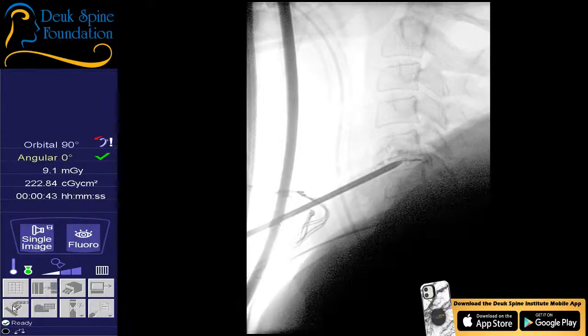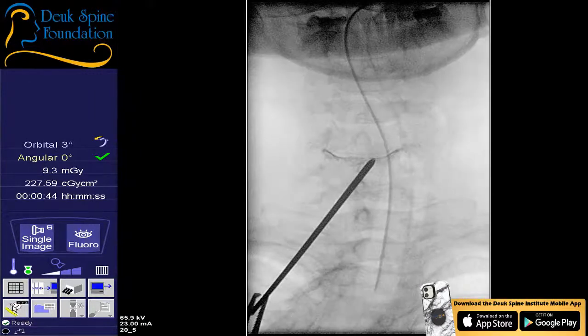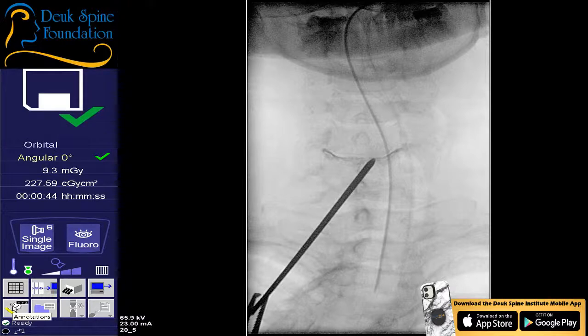Shot? All right, there's some dye. It's gone out the tear in the back. You see the tear? And it's outlining the herniation. Give me an AP. So we just did a discogram at C5-6. Shot. Perfect. You see tears on both sides. So she's got tears on both sides with dye going out both foramen, but she's only symptomatic on the left. Really, that's her primary symptomatology. Yeah. And now we're going to advance the dilator.